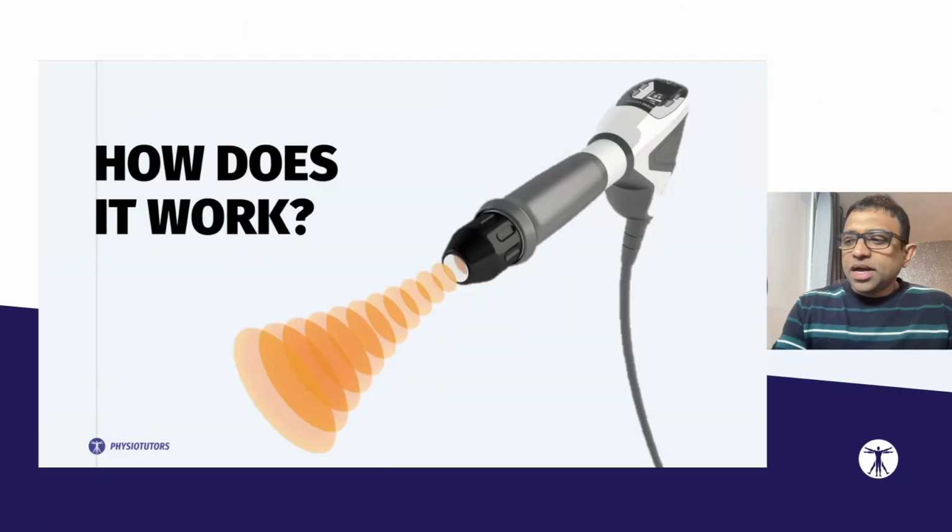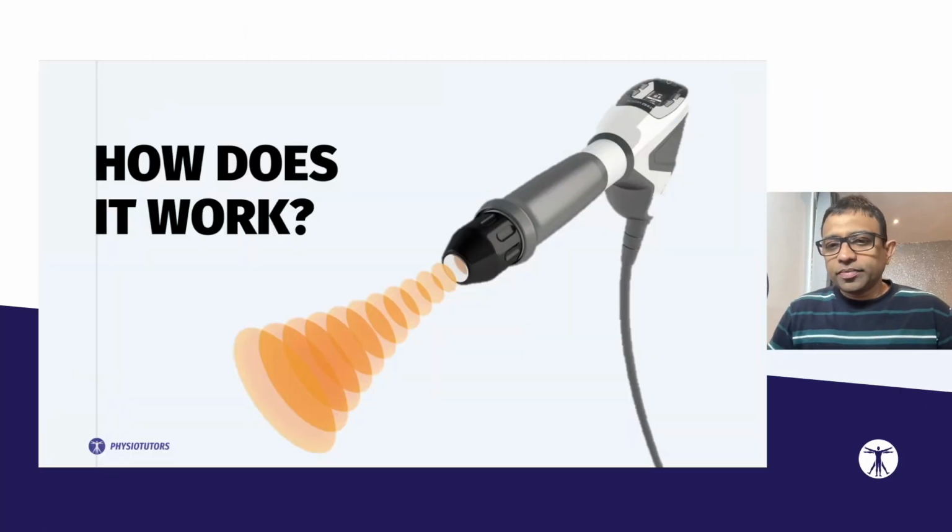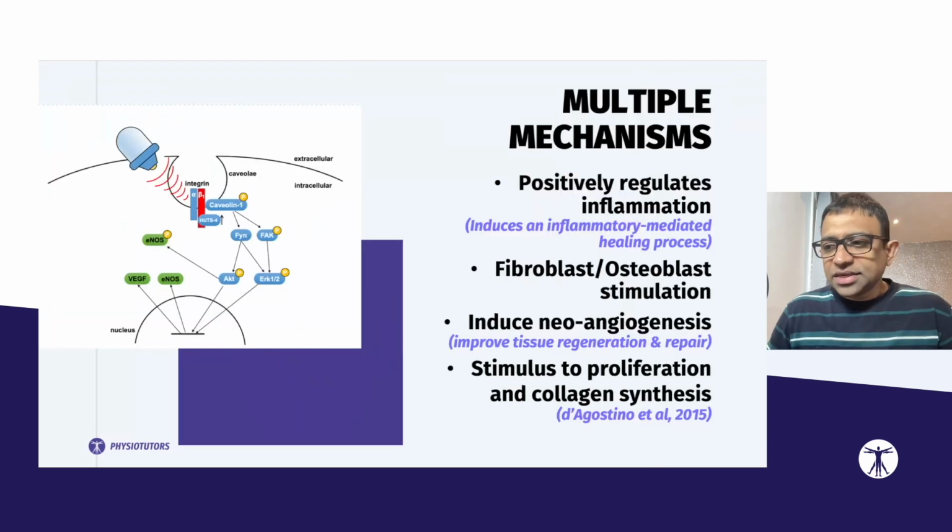The key question people ask is, how does Shockwave work? So clearly, that's an important element which we need to discuss with the patients. And what we know from the research is it works through multiple mechanisms. One of the key mechanisms is that it creates cavitation through mechanotransduction. Mechanotransduction is a process by which your body is able to convert energy, for example sound energy, into biological healing. So one of the ways I explain it to patients is I'm using sound energy to kickstart healing.